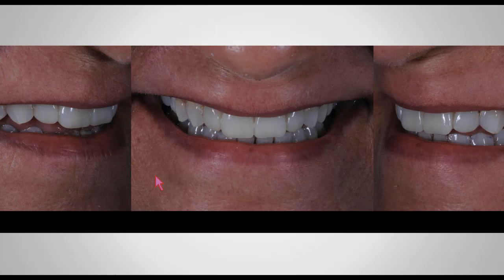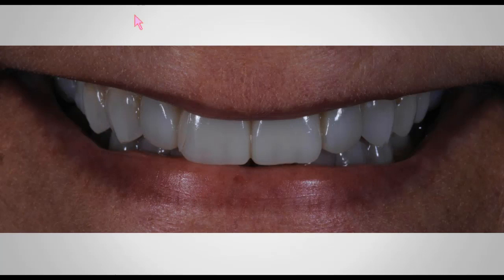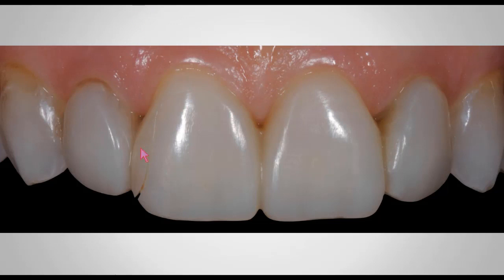And I'm taking all these photos, making sure the incisal edge position is correct, just making sure that she feels comfortable with my temporary bonded prototypes. Now, a week later, you can see this is the area where the connector was hitting when I had that hyperocclusion there, and you can see the fracture that happened because of that.